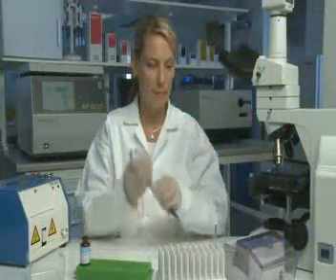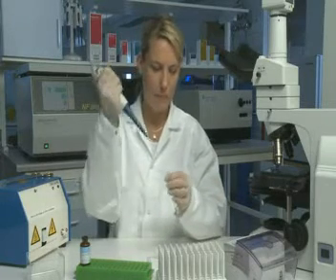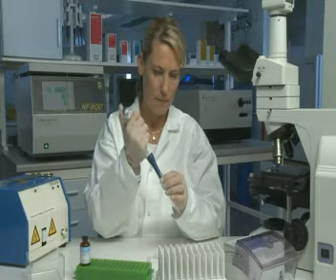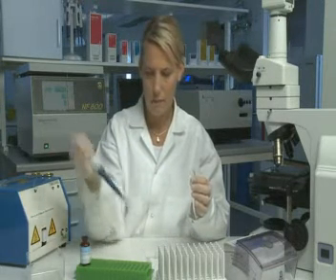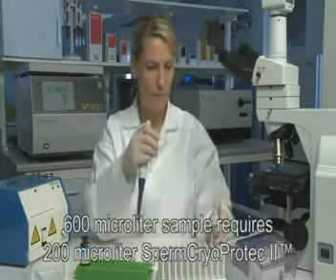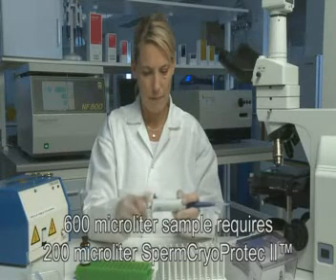Place the sperm sample to be frozen into a sterile tube. The tube's size is dependent on the sample volume to be frozen. Calculate the volume of Sperm Cryo-Protect 2 needed by dividing the sample volume by 3. For example, a 600 µL sample requires 200 µL Sperm Cryo-Protect 2.